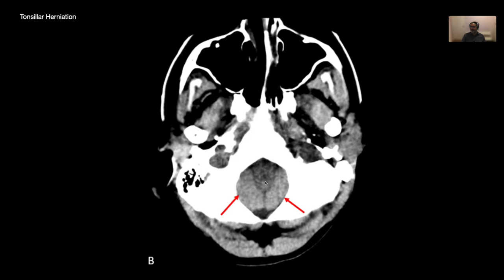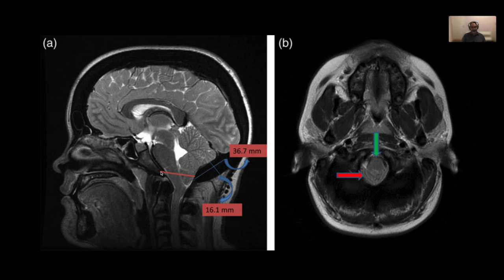Yes. Very quickly, absolutely. So this is something that's a nice one. That's a tonsillar herniation on MRI. MRIs are really pretty, but getting an MRI for a tonsillar herniation, you're also like, what are you doing? It's like when you see the tension pneumothorax x-rays and CTs, you're like, how did that happen? How's that person still alive?